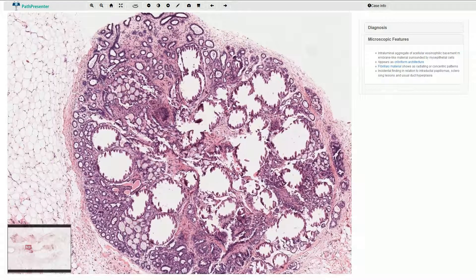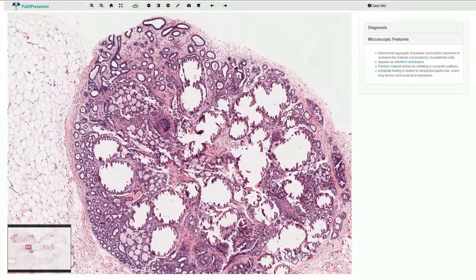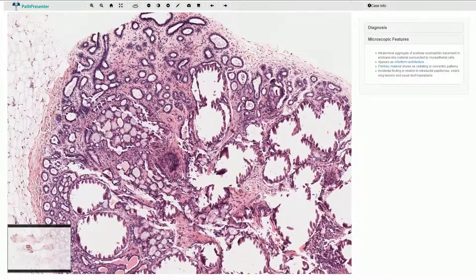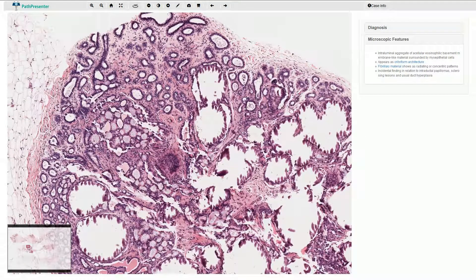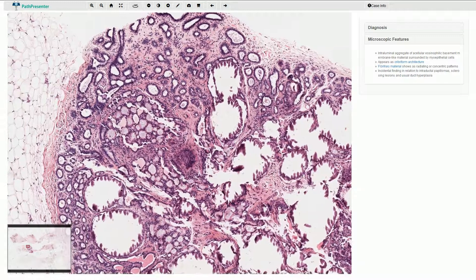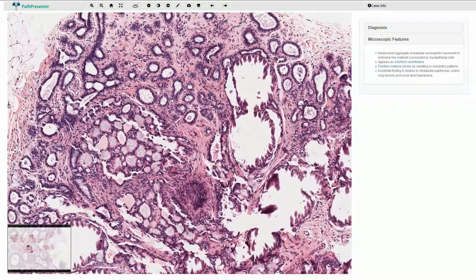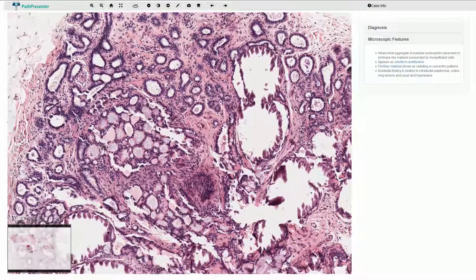On the periphery of this nodule we can see multiple small ducts and some of them are slightly dilated, but they are not fused together and most of them are not associated with epithelial proliferation.